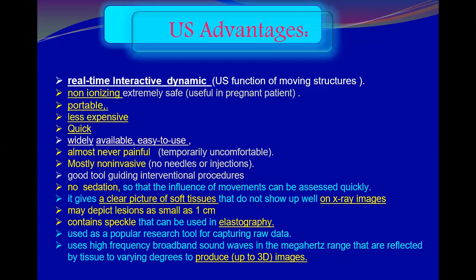The most important: non-ionizing, accessibility of ultrasound, relatively low cost, quick, a unique opportunity for real-time guidance of needle biopsy, an easy approach. If we find a lesion, it is easy to biopsy using ultrasound, and so forth.